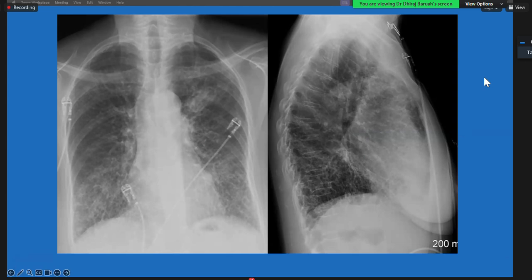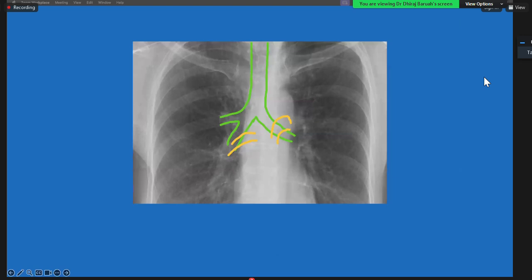It is very important for CT scans, particularly when you are imaging for congenital abnormalities. My cardiothoracic section takes care of a lot of congenital heart disease, and in those cases we look at this very carefully. For the sidedness of the lung, you can have right-sidedness or left-sidedness, and that will give you different differentials, and some associated congenital anomalies are more common on one side compared to the other.